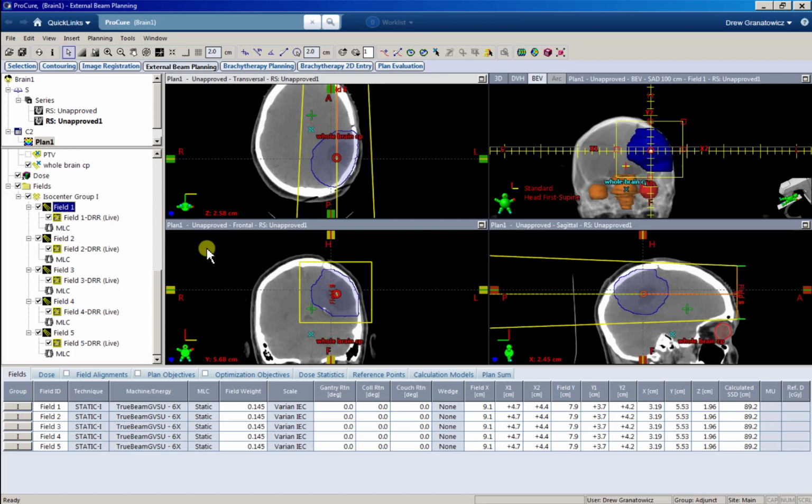Anything less than 5, and you're really not going to be as conformal as you probably should be for a true 3D conformal plan. Anything over 7, I don't feel like you see a whole lot of benefit. I'm not saying you can't have a real 3D CRT plan with less than 5 or more than 7. It's just that's usually the case.